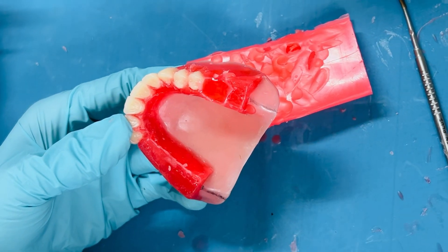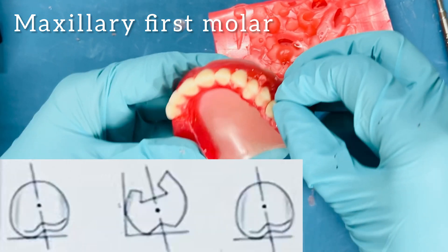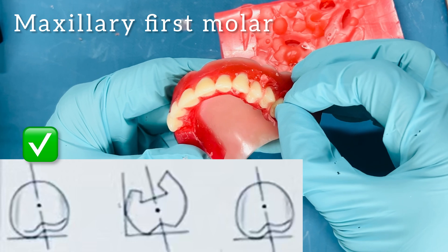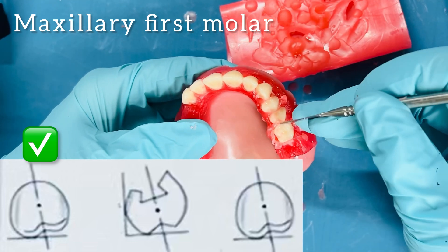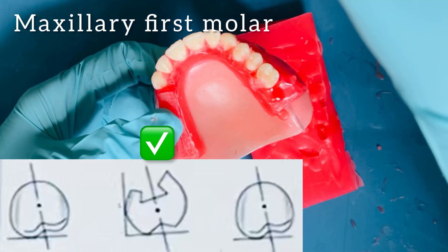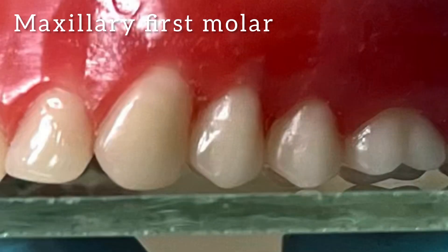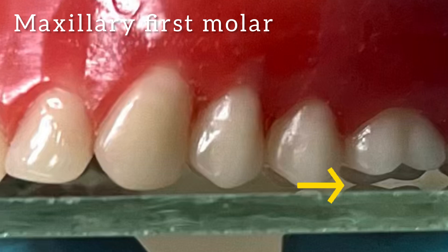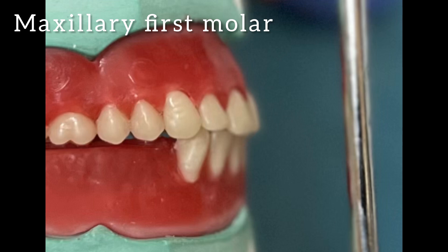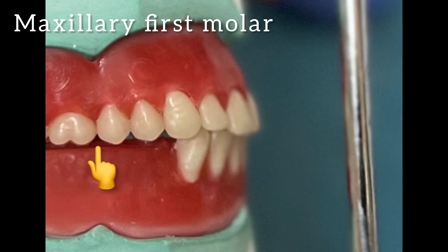Moving on to the maxillary first molar. Soften the wax and arrange the maxillary first molar in such a way that the long axis of the tooth is inclined distally when viewed from the buccal aspect. When viewed from the side, give the tooth a buccal tilt. Giving the tooth a buccal tilt brings the palatal cusp closer to the glass plate. While checking glass plate relation, make sure only the mesopalatal cusp comes in contact with the glass plate.